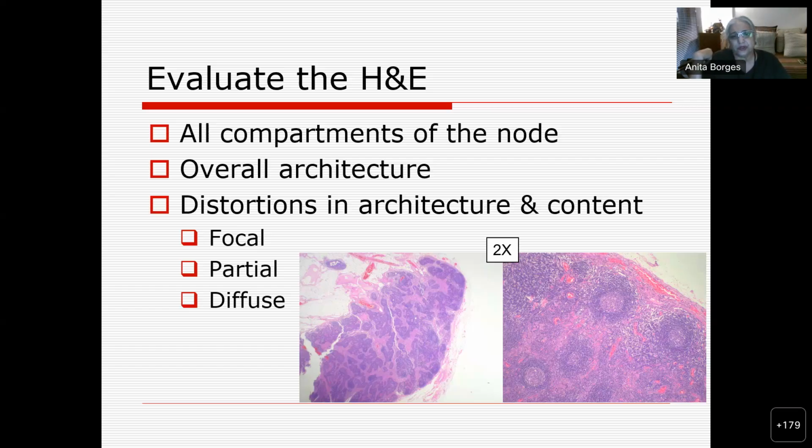There is repair and regeneration and other things going on. Of course, everything is in flux. You know that the marrow is also in flux, and so are many systems which are regenerating all the time. But one of the most plastic systems from the point of view of normality, so to speak, is the lymph node that you see. So yes, there is something that we might recognize as a cortex, but it isn't anything like as constant as what you see in the kidney.